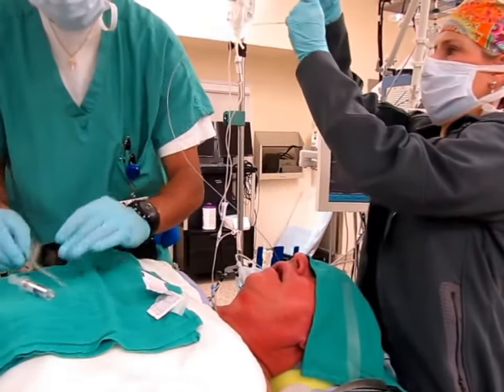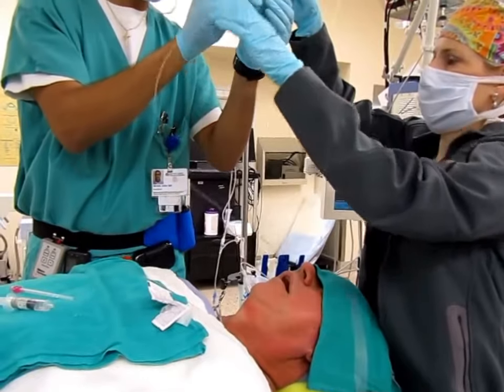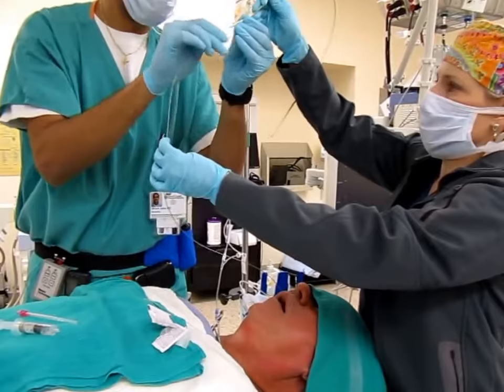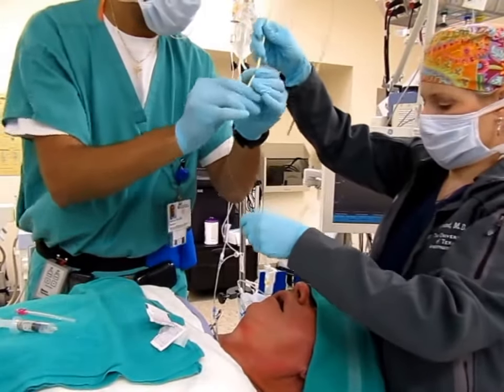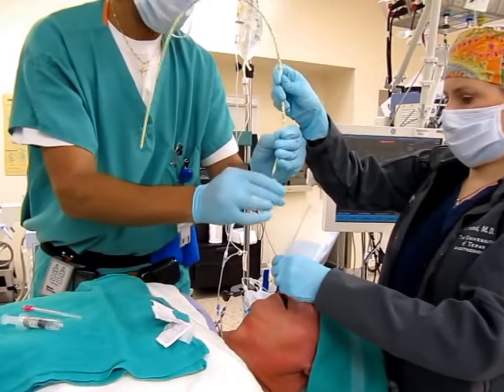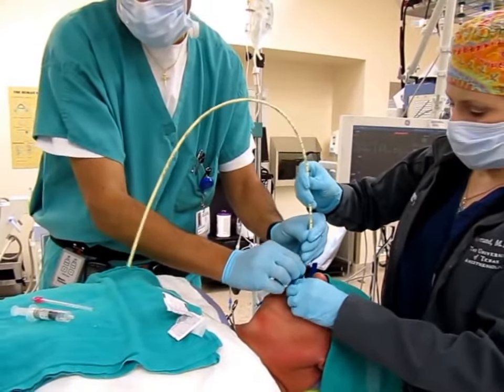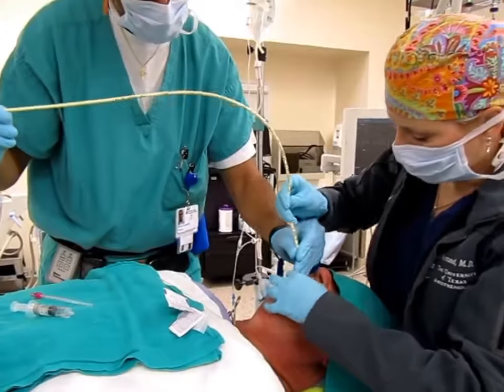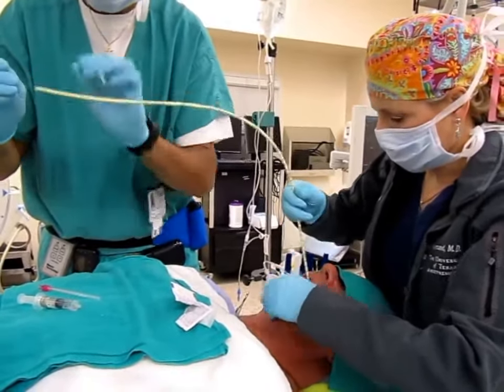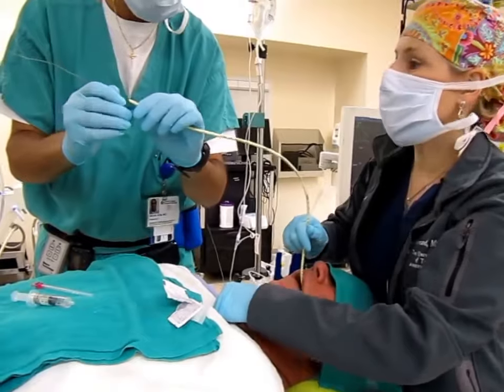Now we're going to put the cook catheter in and thread over the guide wire. I've lubed up the cook catheter. The guide wire's length is marked with another black line — you want to see that black line. Do you see the black line? It's right here.